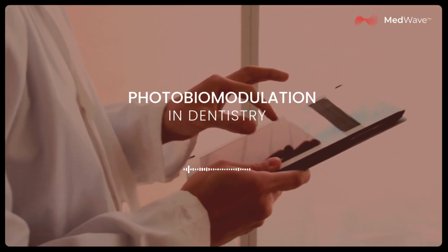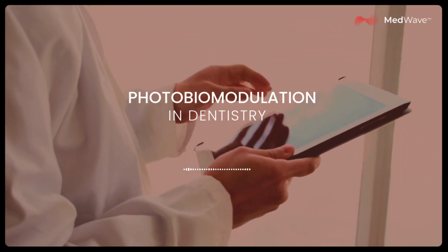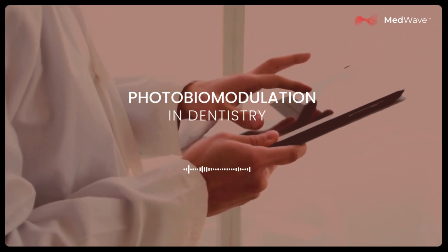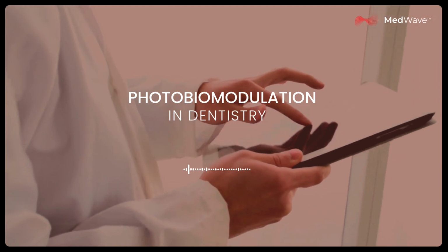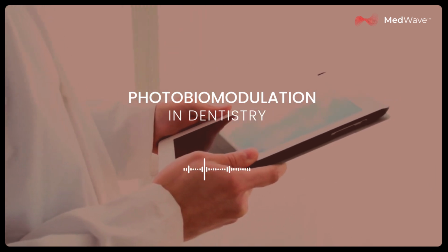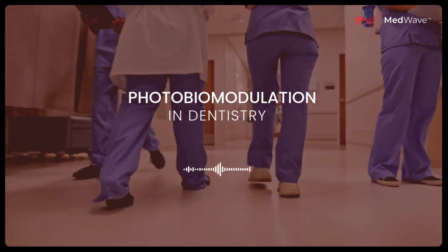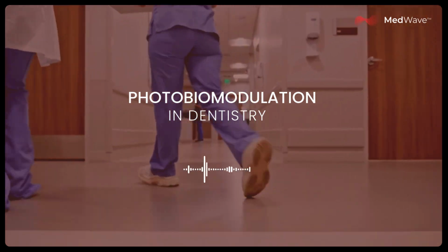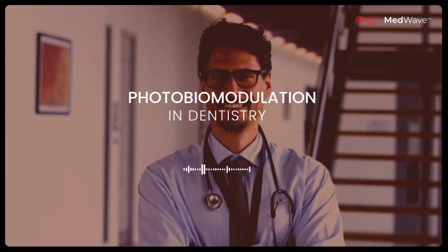And it's not just about speeding up healing. It's about improving the quality of healing as well. For example, one study found that using a 635 nanometer diode laser led to significantly greater secondary stability and bone density in patients with dental implants. Now, when you say secondary stability, what exactly does that mean for someone who's considering implants? That's a great question. Secondary stability refers to how well the implant integrates with the surrounding bone after the initial healing phase. So it's basically a measure of how strong and secure that implant is within the jawbone. So this laser is helping the implant become more firmly anchored in the bone. Yep. That sounds crucial for long-term success.